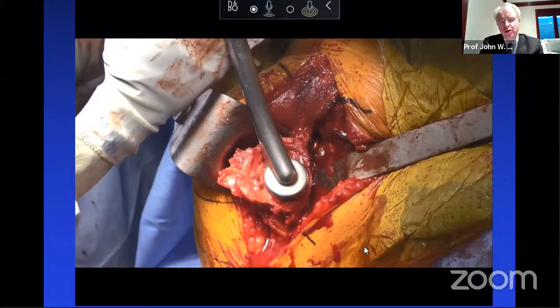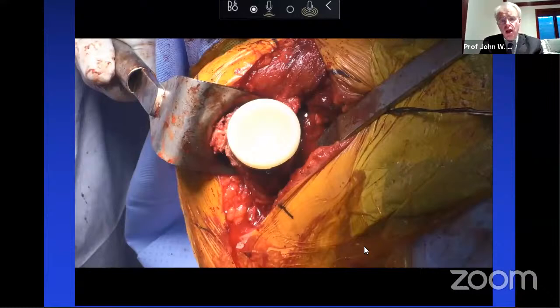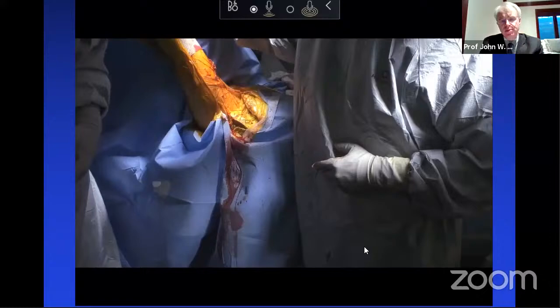We'll tap that down. You'll see the circle on the broach is on the inferior part of the humerus, and that offset tray then covers the humerus the way we would want. And then there's the motion we're able to get with that patient. Nice rolling motion, nice overhead motion for this patient. So that's just the typical reverse that we do now with the patient-specific instrument. And there's the post-op x-ray, the offset tray, and the augmented base plate.